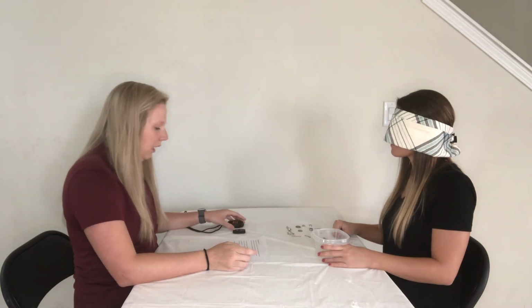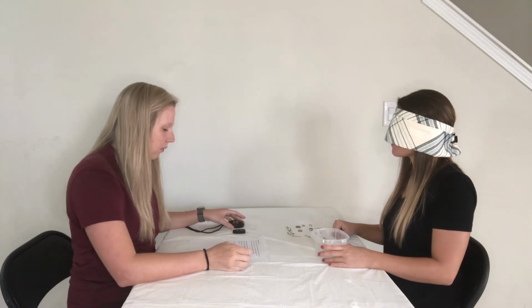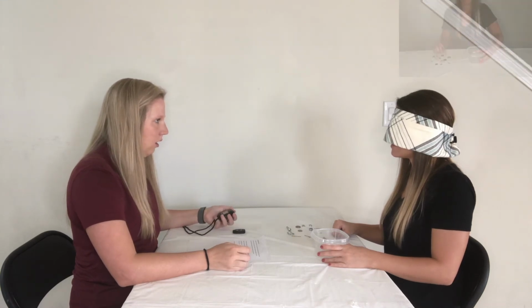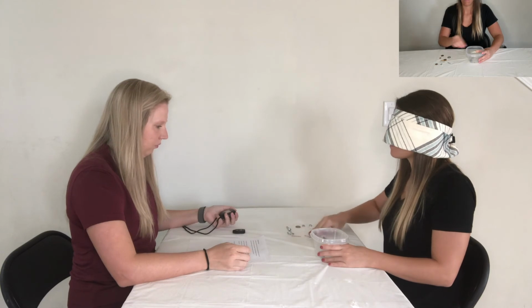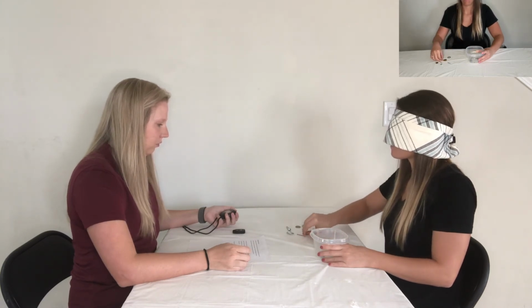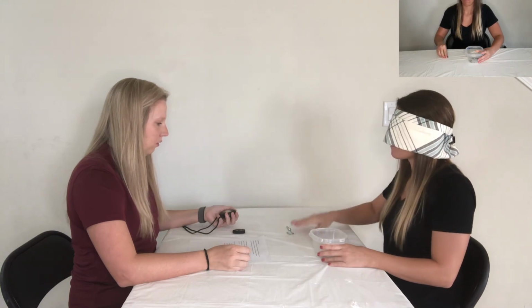You will begin by picking up the items one at a time and placing them into the container as fast as possible. You are not allowed to slide the objects on the platform when picking them up. You may begin when I say go. Are you ready? Yes. Go. You have 3 items left.